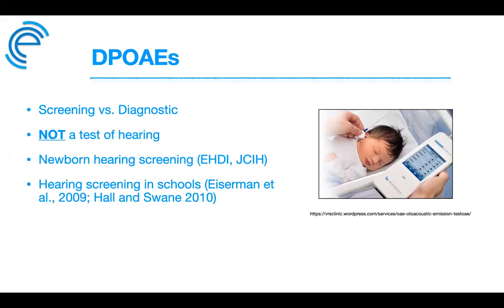More specifically, there is a study done by Berg and Durkin in 2006, where they say that DPOAEs and tympanometry are preferable to pure tone screening, because pure tone screening had unacceptably high referral rates of about 70%. And the American Academy of Audiology, in their childhood screening guidelines, says that DP screening has way lower referral rates, about 6%, and this is shown in many studies.